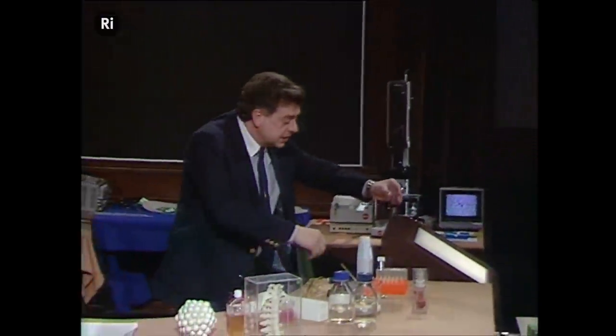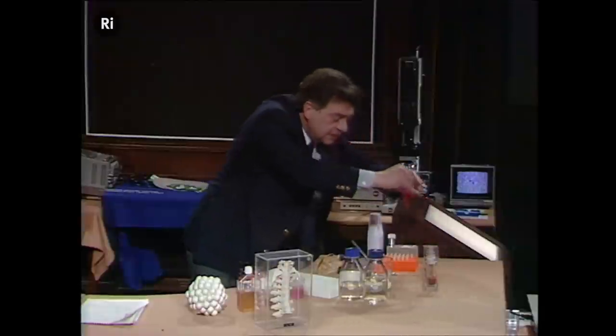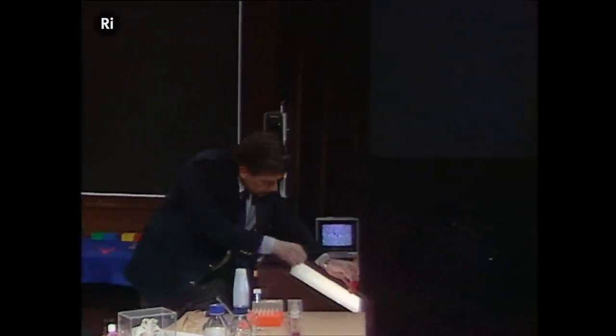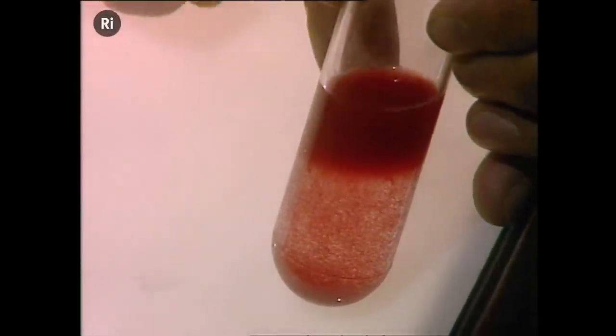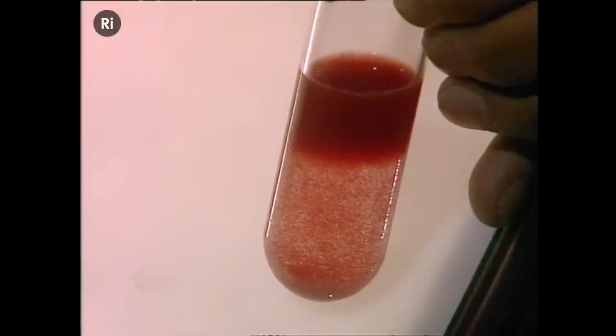Now, we've got a sample that we did just that with some time ago, and let me show you what's happened in the time since we did it. You see, there's the sample to which we did that, and already you can see that just sitting in the stand, a lot of the red cells have started to sediment. And you're beginning to see something accumulating there.